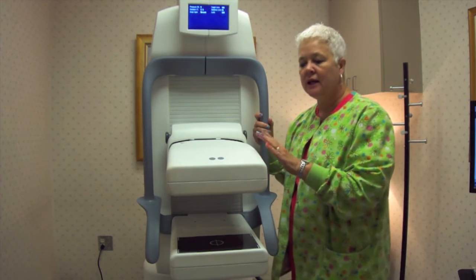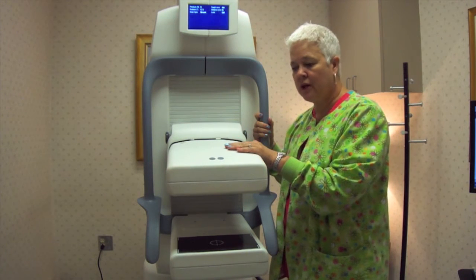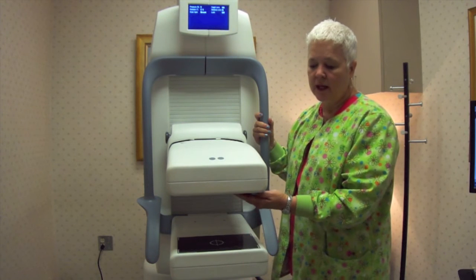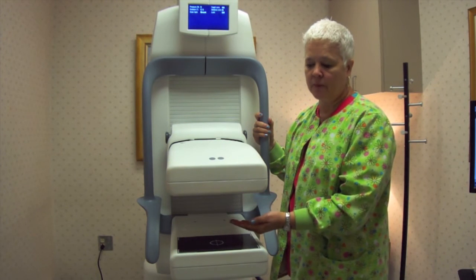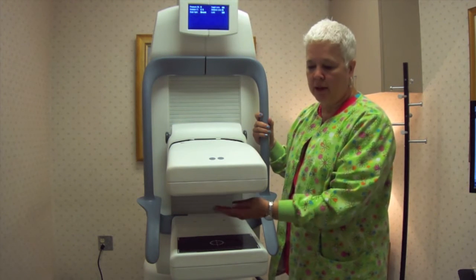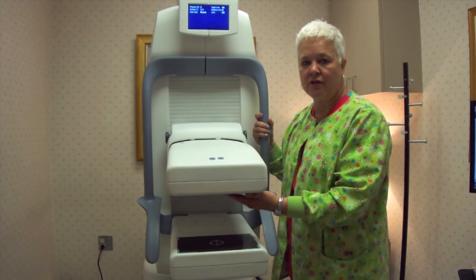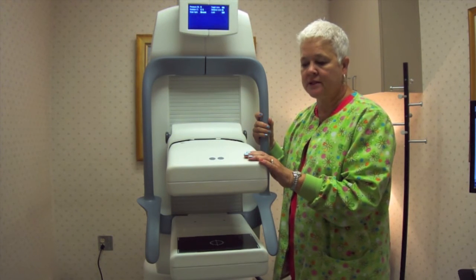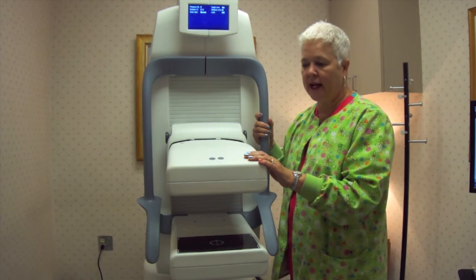This is our new GE dual head molecular breast imaging system. Dual head, meaning that the top portion of the machine and this bottom plate are both dual head imagers. Once the breast is placed here, both plates pick up information from the breast, and of course it is sent to a computer and analyzed there.